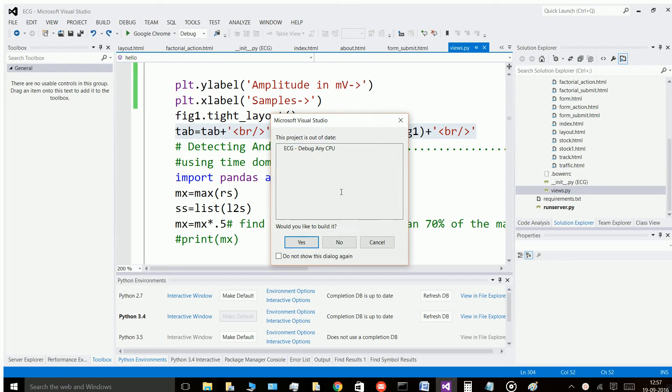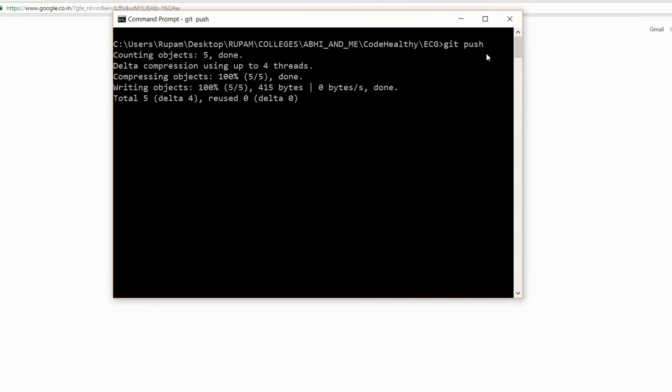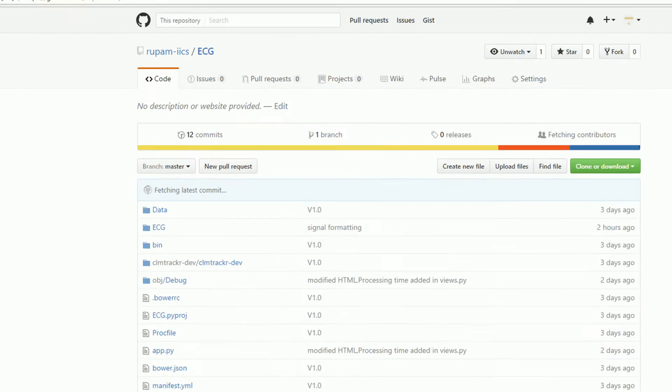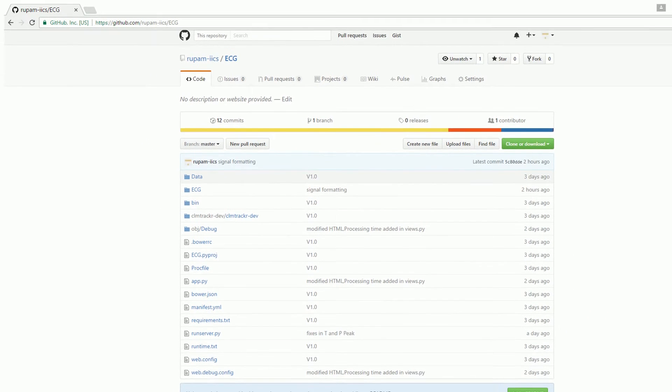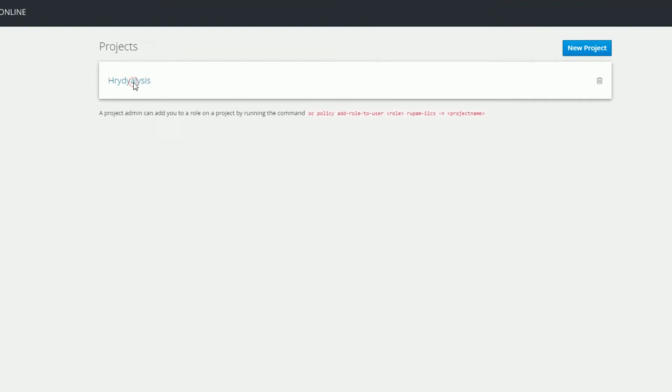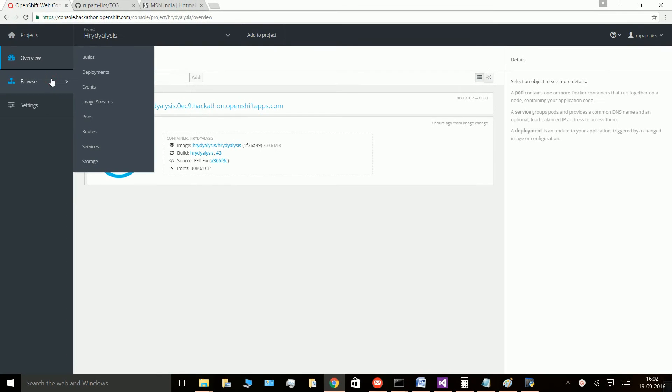Upon successful testing on localhost, the project was pushed to GitHub. OpenShift then builds an image from the GitHub URL link.